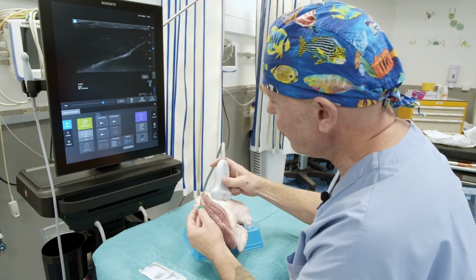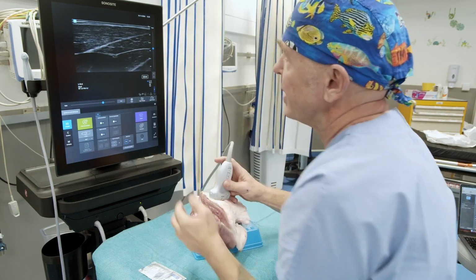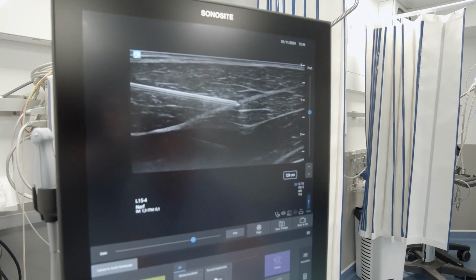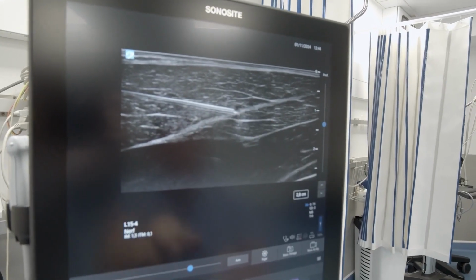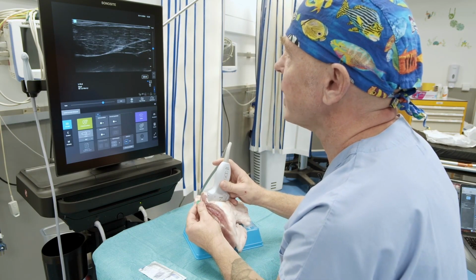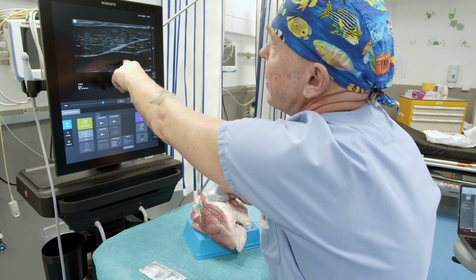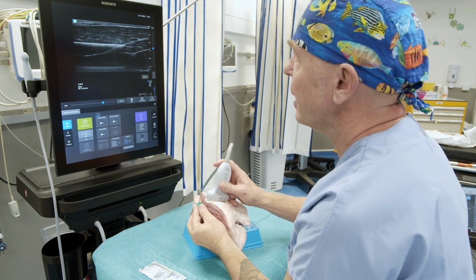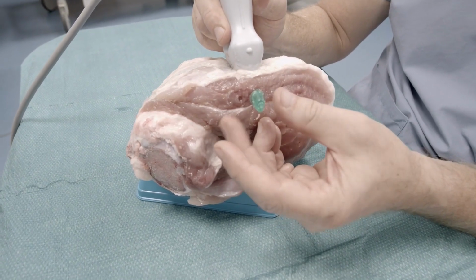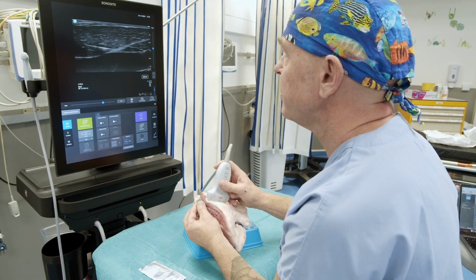But then we retrieve the needle. So let's imagine, for instance, that we intend to proceed here, and then afterward, well, under visual supervision, we continue. There we go. You withdraw your needle. Okay, and then you advance it, there you go. So you observe I've slightly lost alignment, perhaps I'm not entirely aligned, so I perform a minor adjustment, and let's envision, for instance, we're executing a pectoral block or something similar. Well, that was my intended target, and then imagine you're performing a pectoral 1 and a pectoral 2. It's quite straightforward to learn how to accomplish that under controlled conditions. I withdraw slightly, adjust the angle, I lose it, then I reposition, just as in real life scenarios.